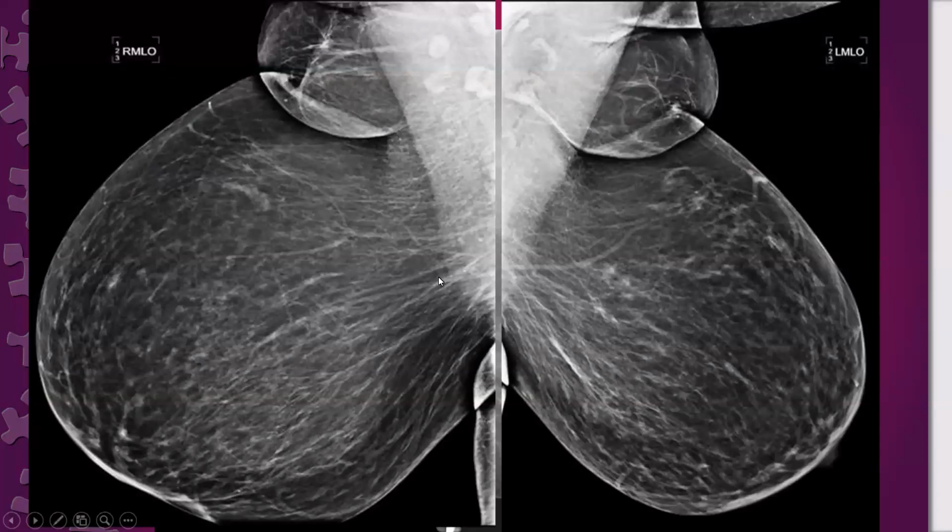In the abdomen? Projecting over the axilla. Yeah, projecting over the axilla. Say it completely, Suhair.